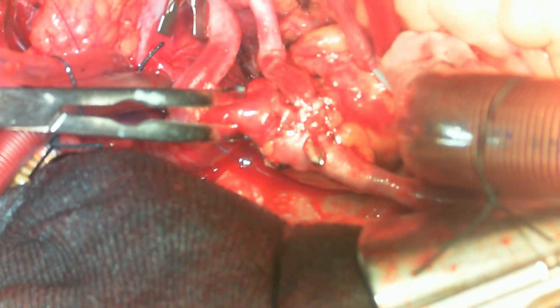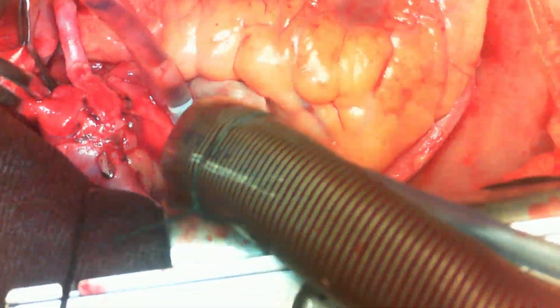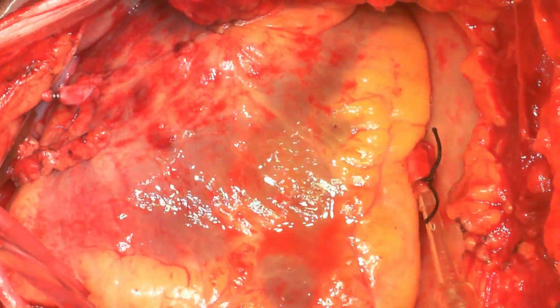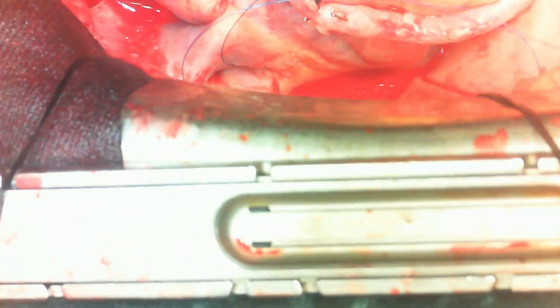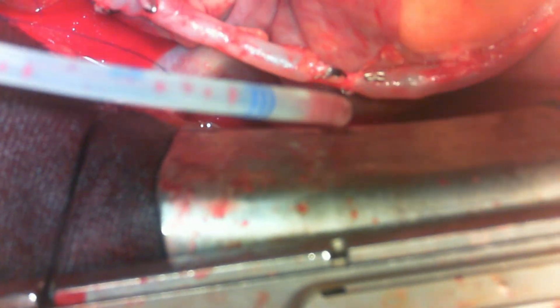The ascending aorta is fully cross-clamped with pressure lowered fully, and cardioplegia is administered. The clamp is between the diagonal and RCA grafts, but the OM graft is still perfusing the heart, so a bulldog is placed on it. As the heart arrests, the left ventricle is vented to prevent LV distension from returning blood. A vent is placed along the right superior pulmonary vein and passed into the left ventricle under guidance. The LV vent is turned on.